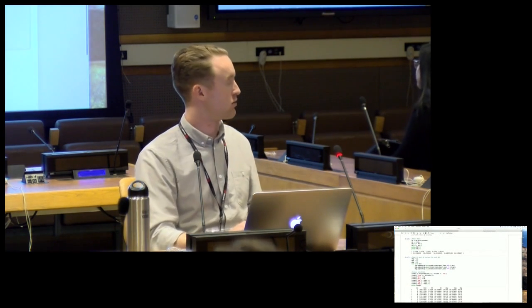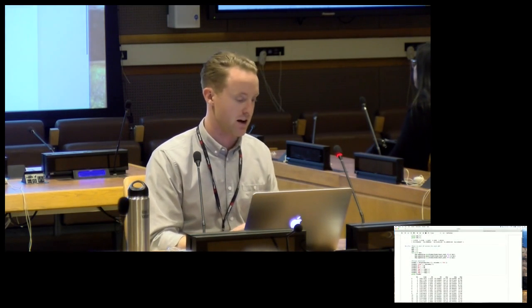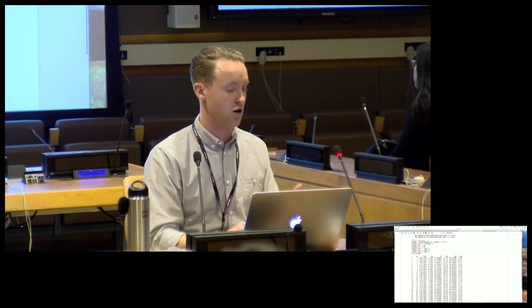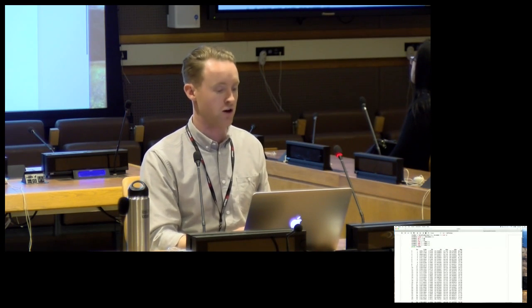From that we can calculate the local max, mean, and min - which are the systolic, mean, and diastolic blood pressures for each heartbeat. I made an output DataFrame that's really easy to build from scratch with all of my data - for each heartbeat I've got what time it happened, the RR interval, heart rate, and systolic, mean, and diastolic blood pressure. But from there we're not quite done yet.